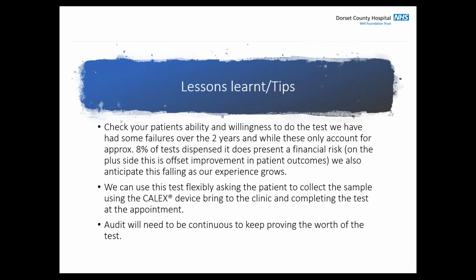So the lessons that we've learned over the couple of years we've been using this is that while the failures are there, they only really account for about 8% of all the tests dispensed. So from a cost analysis point of view, the test is more than paying its way, because if we imagine that for every 16 tests we do, we save one admission, then that's really what we're looking at the moment.